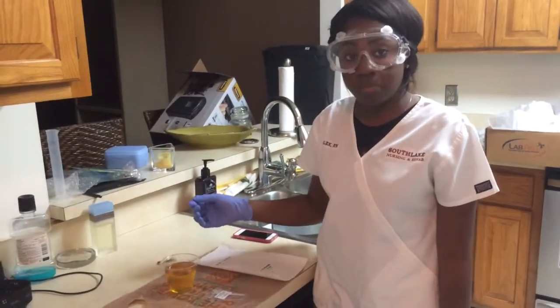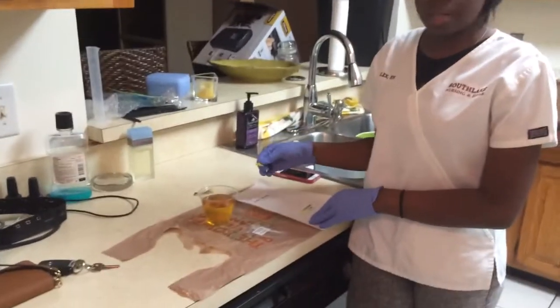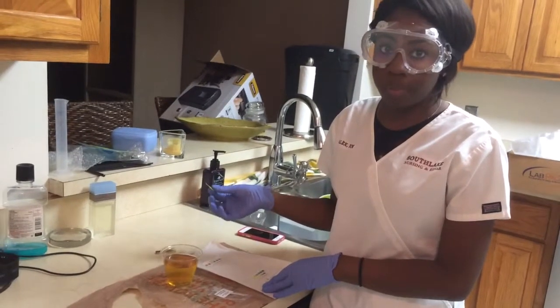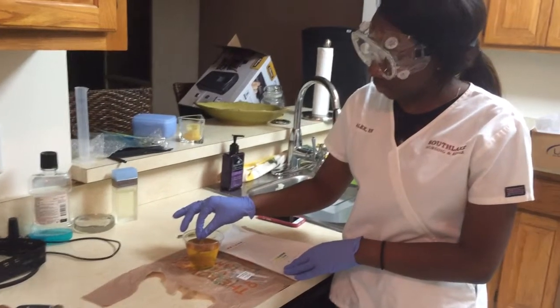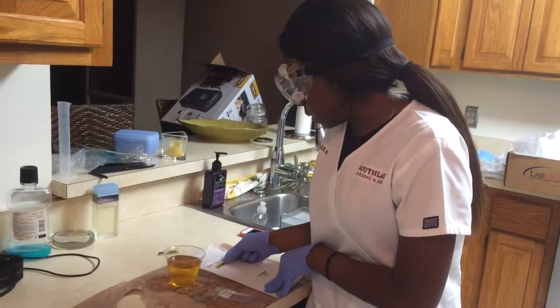Now I'm going to test the pH of my urine using the pH test strips given in our lab pack. I'm going to dip the pH test strip in my urine for about a few seconds, and now I'll place it on my paper towel and see what we get.